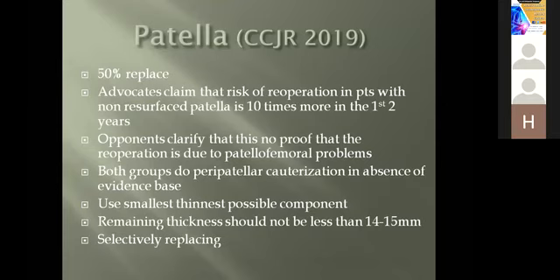If we are talking about the patellar replacement concept, in the Current Concepts in Joint Replacement meeting last December in 2019 in Orlando, USA, the consensus reached these conclusions. 50% of them replace the patella and 50% are not replacing.